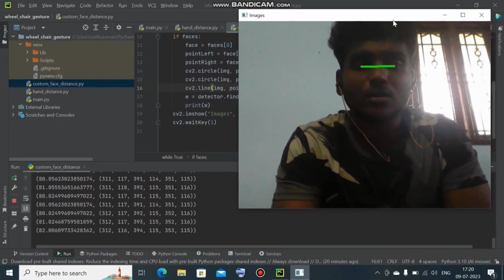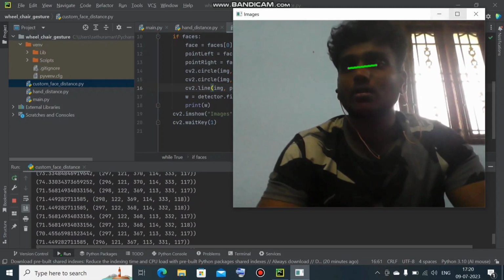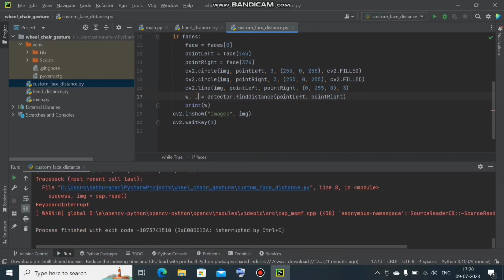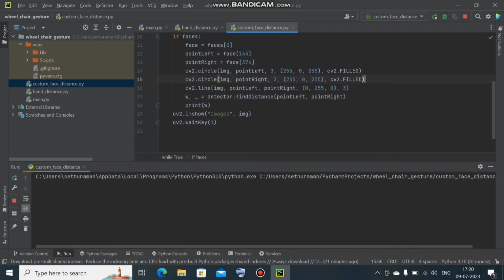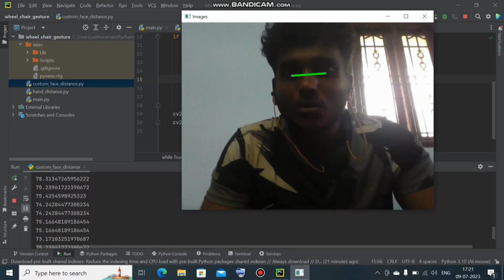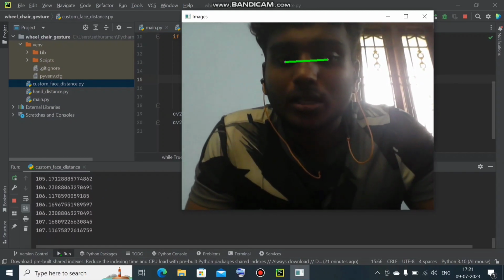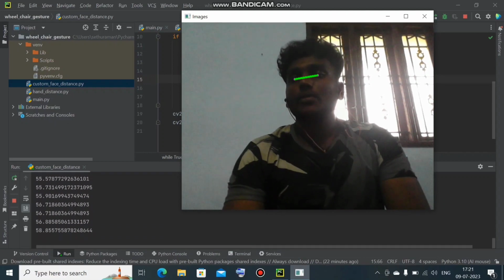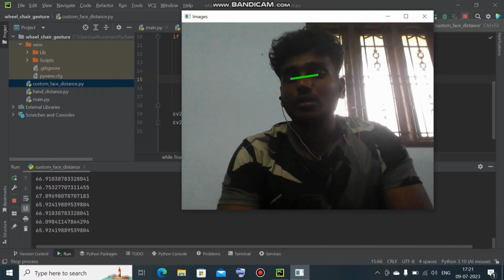You can see now, these are the points. Oh, 2 points are printing. That second one we don't need, so we can just set it as None. And let us run again. Only one result we need, only the left side part. Let us see now. When I go closer to the camera, it is showing 106, 107. When I go back, far from the camera, it is decreasing. But in real time, we need it to increase when we go back and decrease when we come in front.